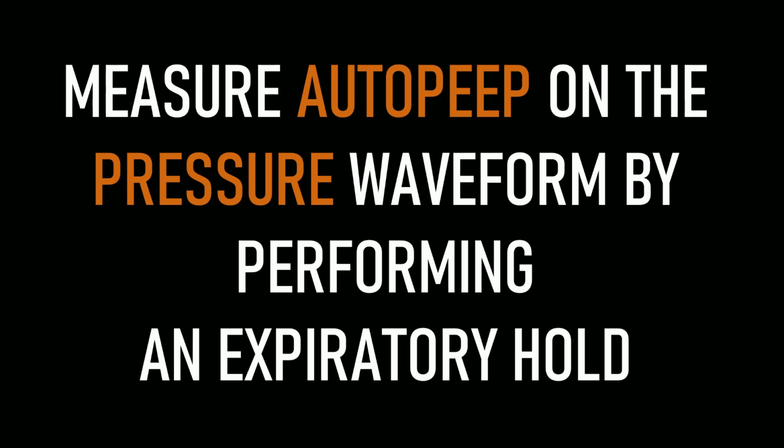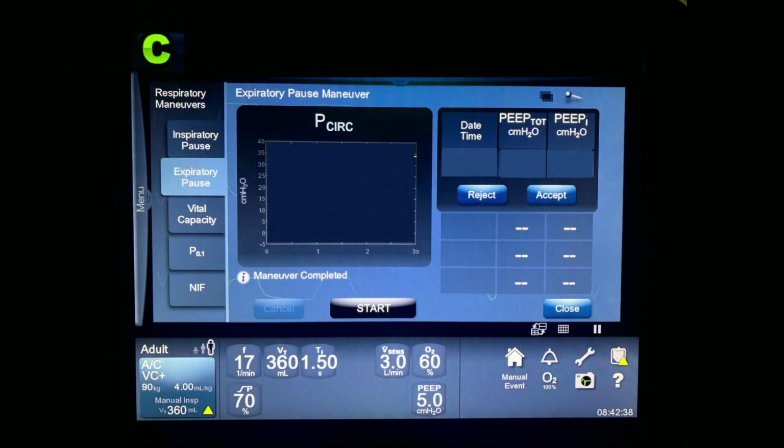It's imperative that you measure Auto-PEEP in any patient who has high airway pressures or is hypotensive. Seeing it on the flow waveform is a great screening tool, but it doesn't either confirm or disconfirm that it's present. In order to measure Auto-PEEP, you need to do a maneuver that is available on all ICU ventilators, the expiratory hold. On this particular machine, we go to the respiratory maneuvers tab.